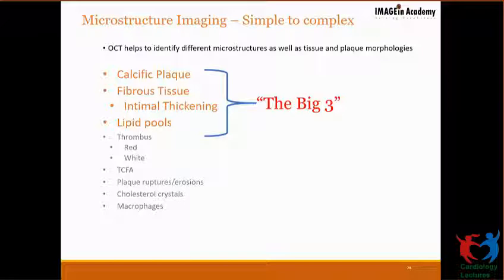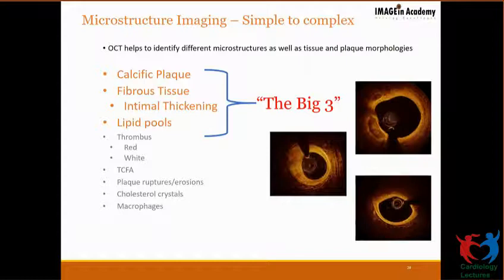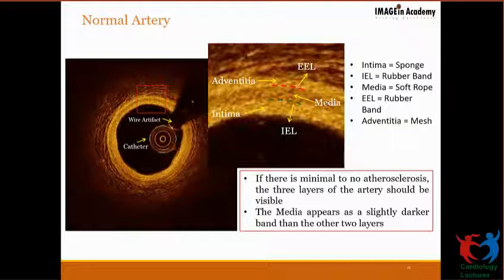So let us have a closer look at these lesions. As is true for ECGs, when we all complete our MBBS, we are baptized into reading ECGs. Once you learn what a normal ECG is, you will easily be able to pick up an abnormal ECG. So the first and most important thing is to learn what the normal structures are which constitute a normal blood vessel wall.